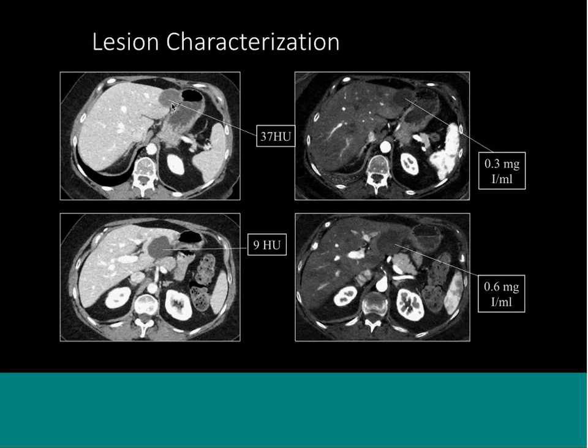37, I have no idea what this is. This is a young female who ends up undergoing an MRI to prove that this was also benign. It was just a cyst with some protein in it. But look, we can quantify the iodine in this.